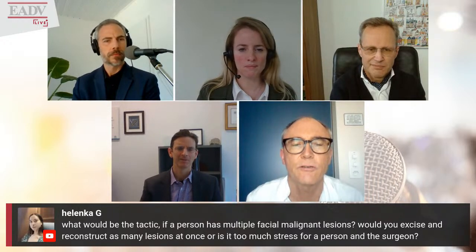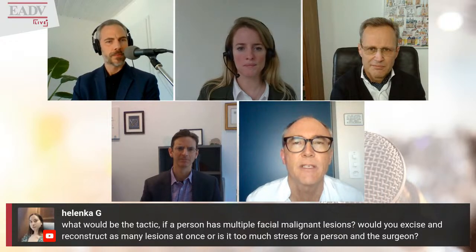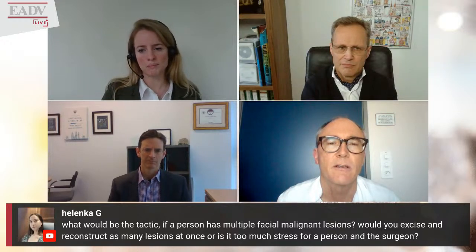I try not to do too many at one time, but when I have to, I try to stage local anesthesia, because this is actually the most stressful moment for the patient mentally and also for his pulse.